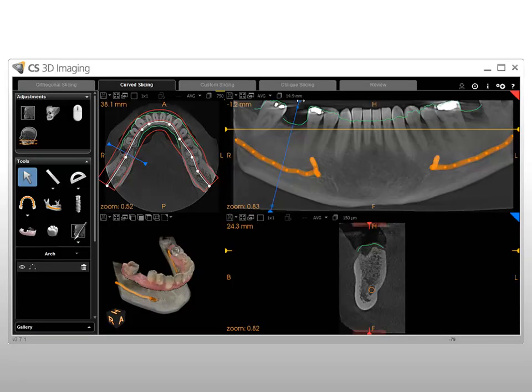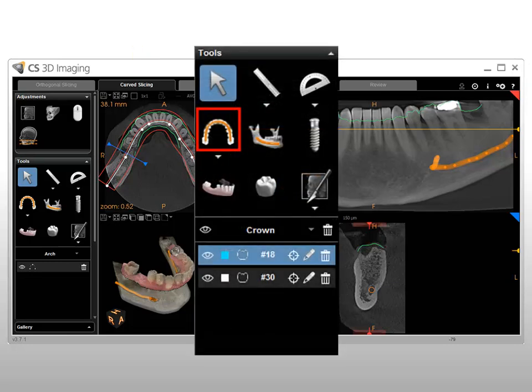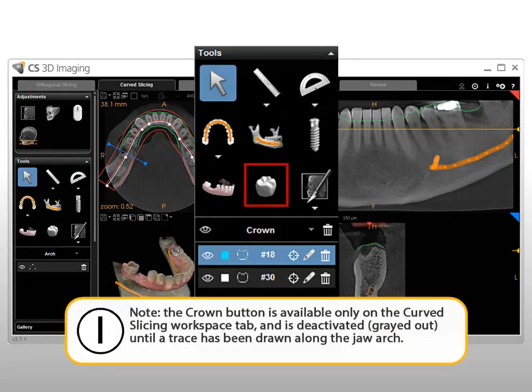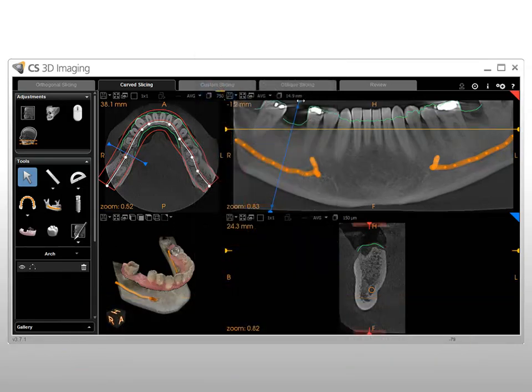To place a crown in the patient volume, on the Curve Slicing tab, draw a trace along the dental arch and align a model with the volume. Note: the Crown button is available only on the Curve Slicing Workspace tab and is deactivated until a trace has been drawn along the jaw arch. Based on your analysis of the anatomical details, carefully select the initial crown position, taking into account the soft tissue data of the digital model and the position and height of adjacent crowns.